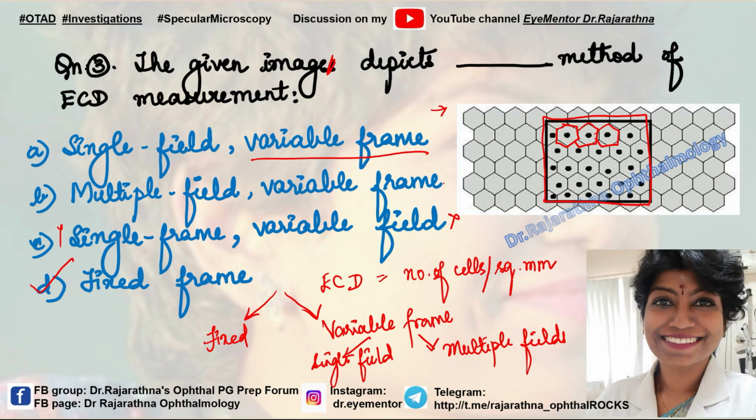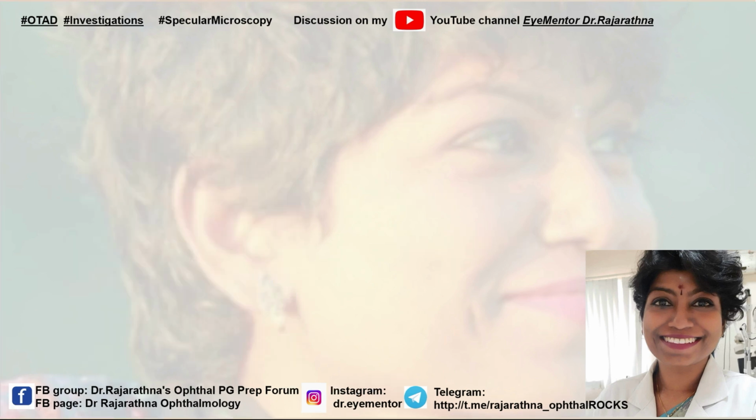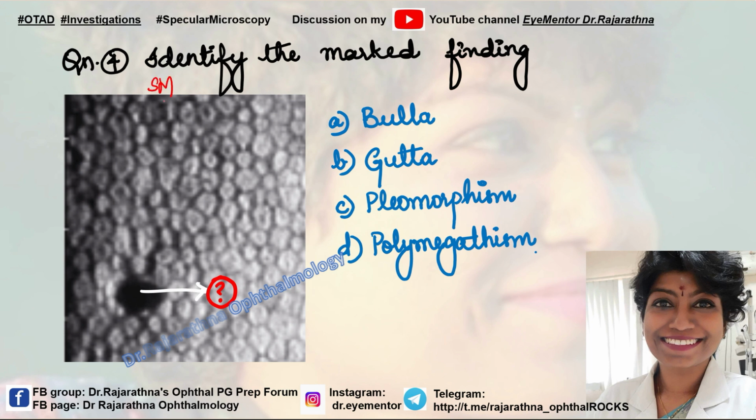So the answer to this question is fixed frame, because the given image shows the fixed frame method of endothelial cell density measurement. Question number 4, identify the marked finding. I hope by now you all know that this is a picture of specular microscopy. Now what is this dark spot? This dark spot is a projection from the endothelium. So that is an endothelial excrescence. It's a projection because the endothelium is abnormal and it is laying down some abnormal collagen, right?